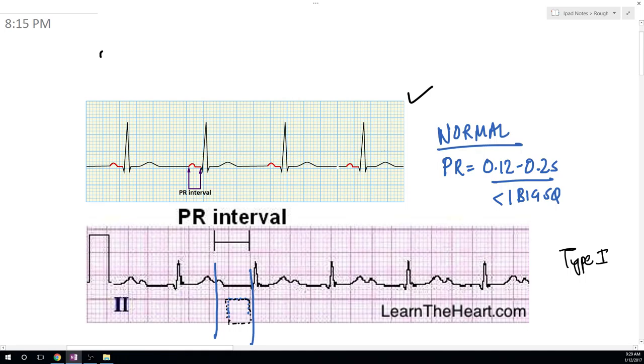First I will be talking about the ECG. This is the normal ECG where the PR interval is shown and it is generally in between 0.1 to 0.2 seconds, that is less than one big square. Now in type 1, there is slowing of the conduction through AV node, so the PR interval will increase and it will increase for more than one big square.